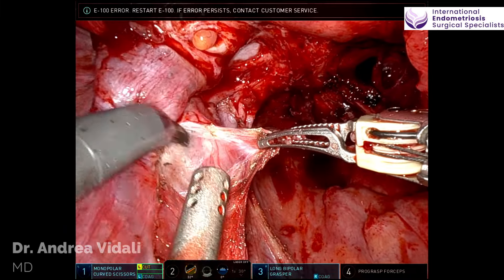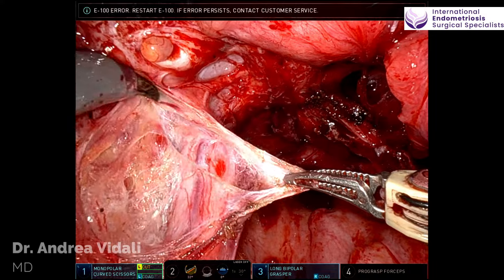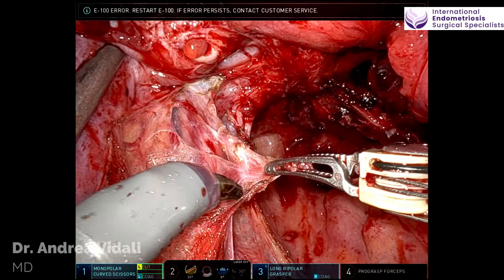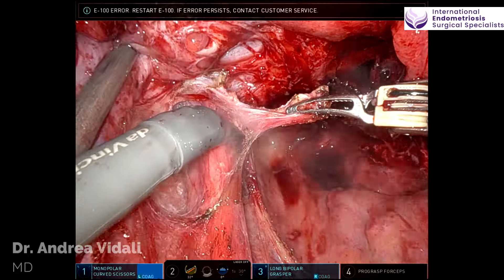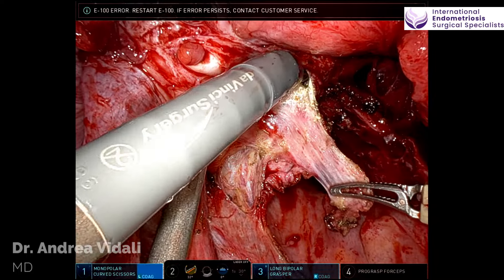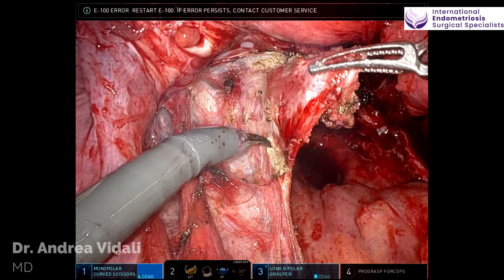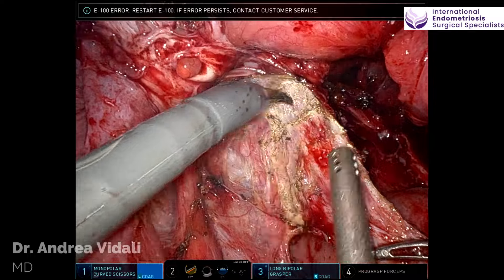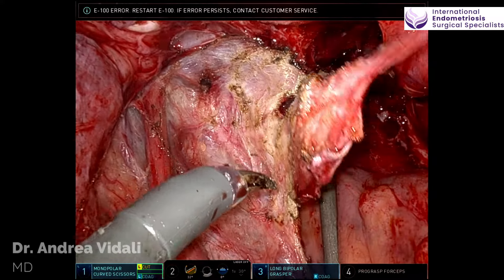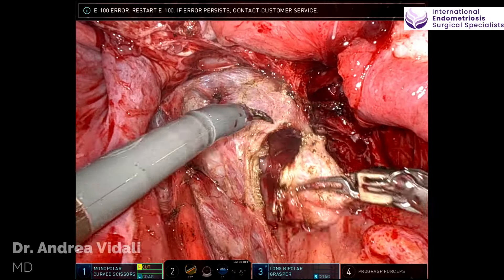In terms of expense, there isn't a huge difference, but this patient was a very small patient, so they had a very small pelvis, and therefore there was very limited space in their abdominal wall to put three instruments. This patient is in her late 20s and has had about 10 years history of disease and pelvic pain, but she was only recently diagnosed. Prior to the surgery, they had their eggs frozen in order to perform some fertility preservation.